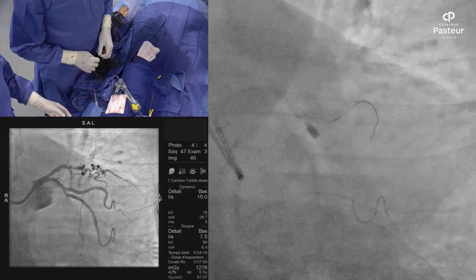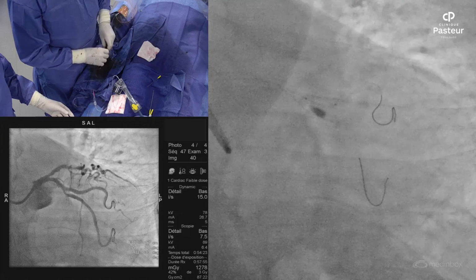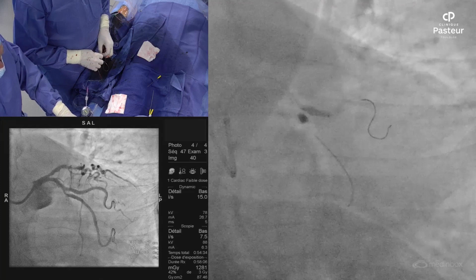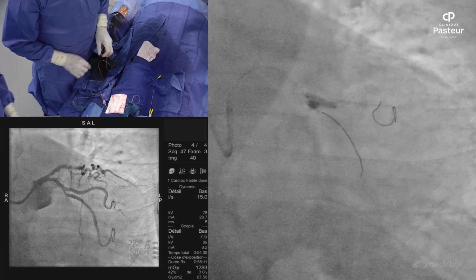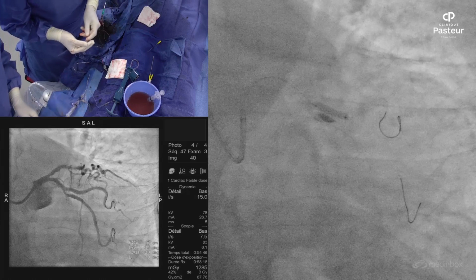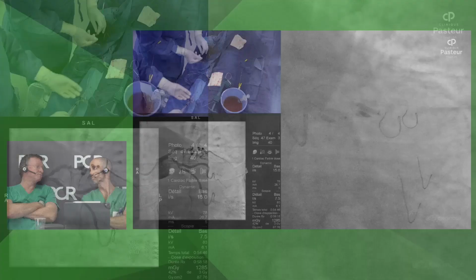Okay. You know the position? Look at the guiding again. Okay, so I inflate now? Yeah, we can. At 4? It's too proximal. Okay, you can leave it here. You can take high pressure. Okay, now we inflate the stent on this one. You advance the stent on this one. This is the 18, huh? We try. It's a very clear demonstration of the difference in performance of a previously used and a fresh balloon, isn't it? Yeah.